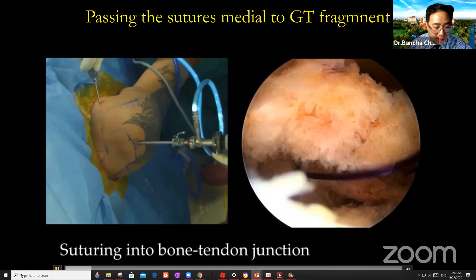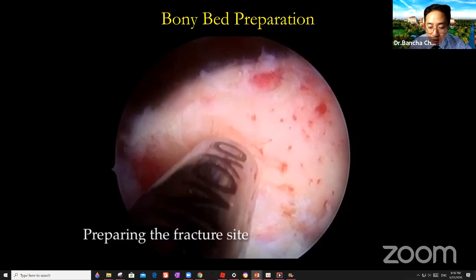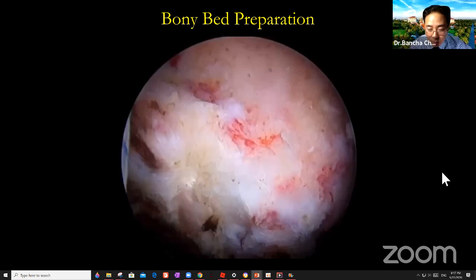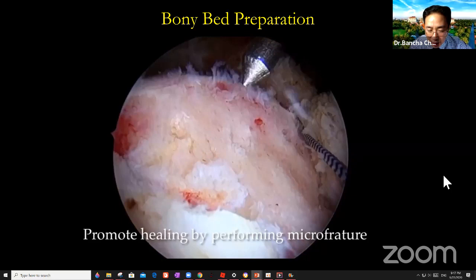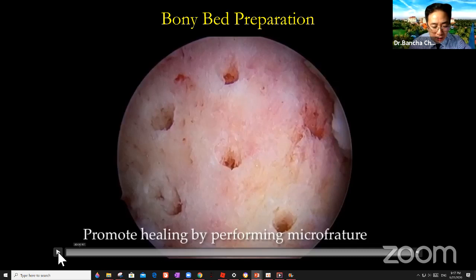After that, we prepare the bone bed. This is quite important. I prefer to use the shaver, and then I do the microfracture at the tuberosity and remove the spur. You see some spur there? Remove the spur and use the microfracture. That's important because you need to promote healing. You see that this is not fresh because the tuberosity is quite sclerotic, and using the microfracture, I think we can promote the healing.